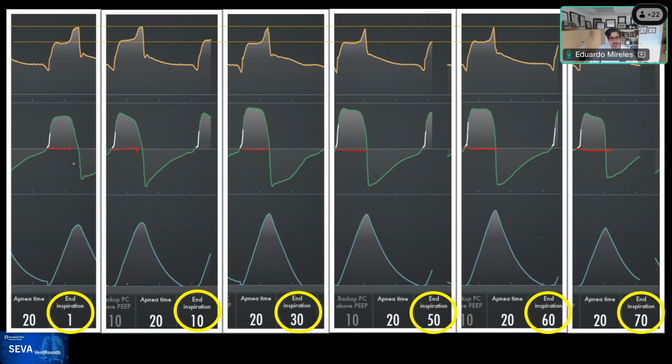Eduardo, did you have the chance to do an inspiratory pause? No, but you have the inspiratory pause right here, technically, almost there, right? Yes, but what I'm trying to say is, you can see the muscle pressure index, and if you get a pause after, it only reflects the period from the muscle relaxation until the system gets in equilibrium. So in a few words, from the point where pressure starts rising, it is just a passive scenario caused by the elastic recoil.